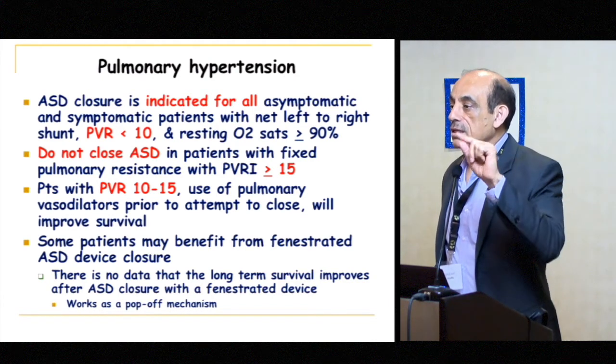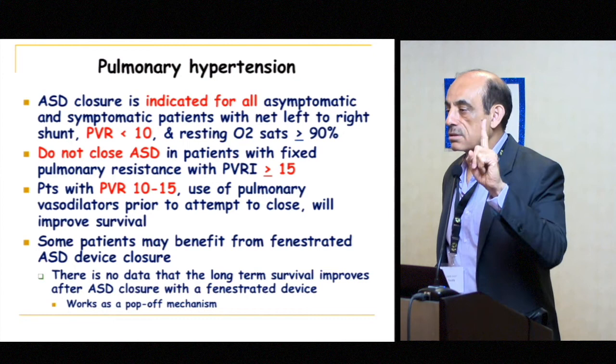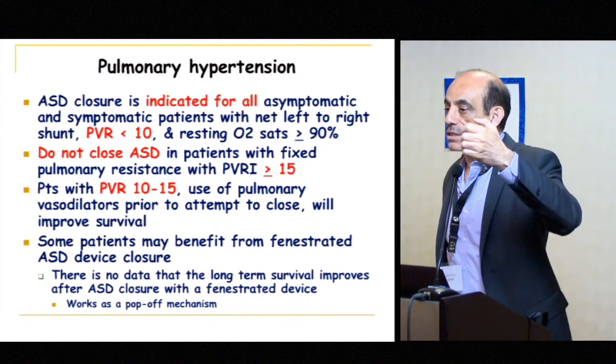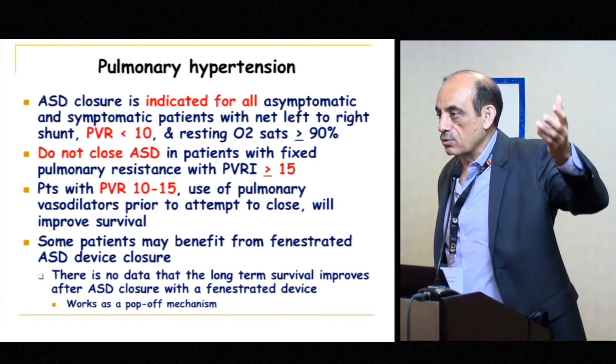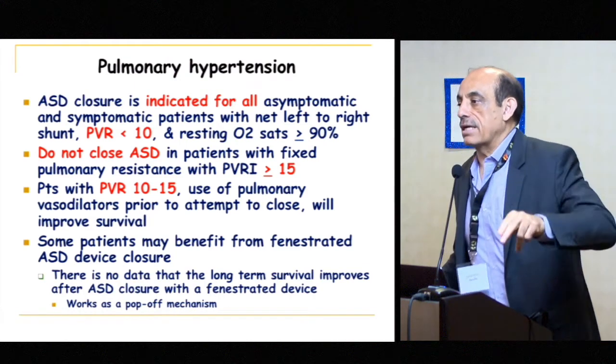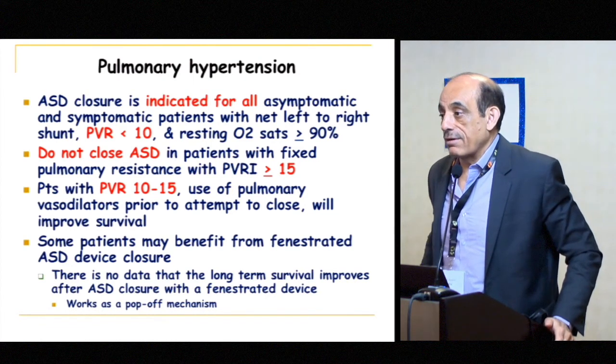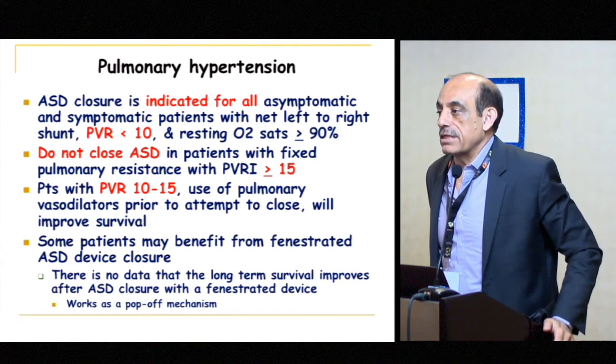So if I can measure the defect in 3 dimensions to get an average, and if I can have a thin septum, which I know when I balloon size is going to fold away, and that's like 2 or 3 millimeters, I will add that to the average diameter, and I'll do it. I have had fairly good success with it.